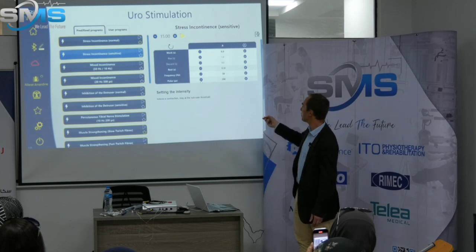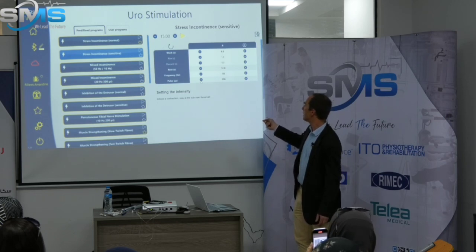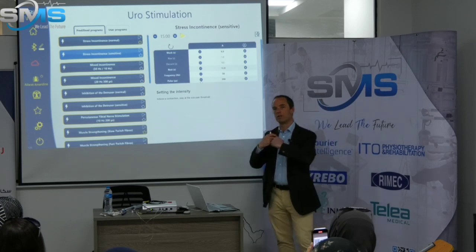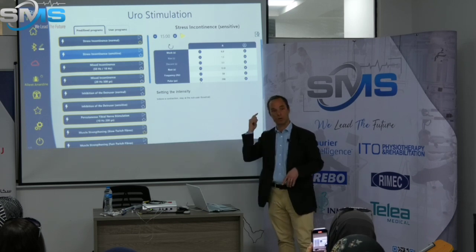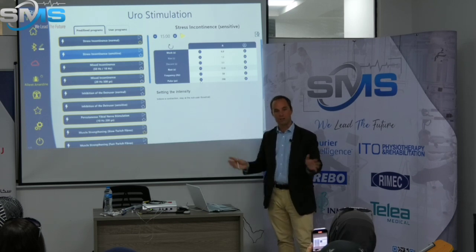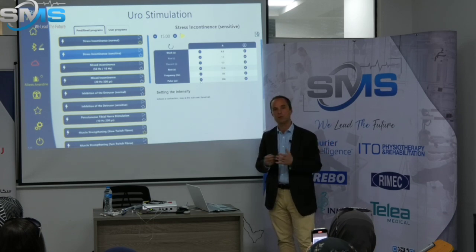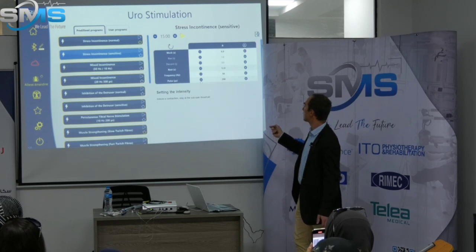The other point that is very important is work time and rest time. You should have a rest time at least 2 times the work time. Because if you're not doing this, you will have a continuous contraction, and it's very tiring for your muscles. And in the evening, when your patient goes back home, she will have leakage, and that's the opposite, even if she didn't have before. So that's obviously not what you want. So never forget to keep an important rest time.